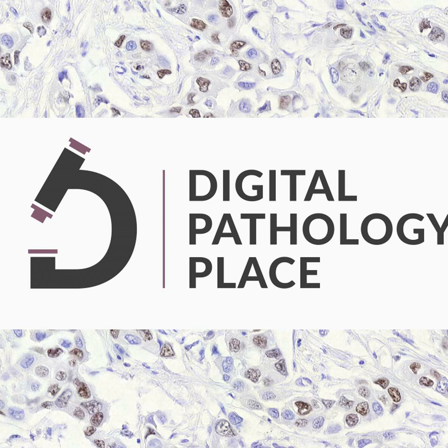One thing is that in the real world, these grading systems are normally continuous. When the cells or tumor start to mutate, there are no exact borders. There's always something in between, so it's a continuous curve. Actually, it should be a number like Gleason 3.5, but no human can give that number. So there are still a lot of things that need to be investigated to get all that can be done with AI. So what would be your recommendation? Let's take this problem of translating scoring into an AI model.